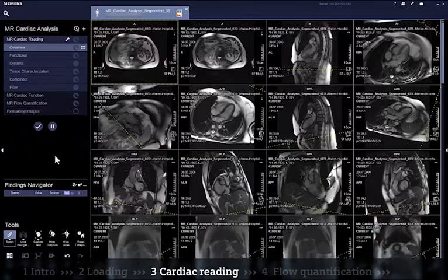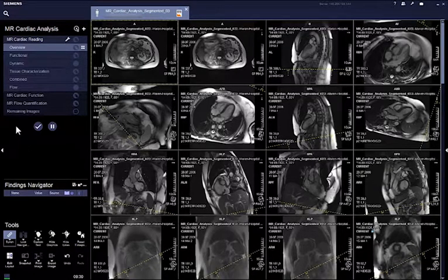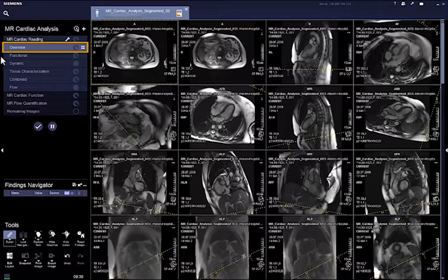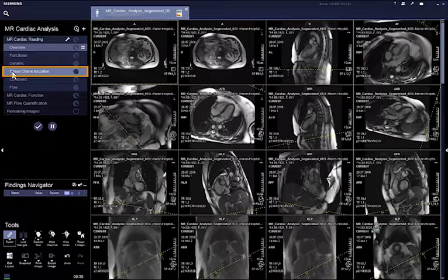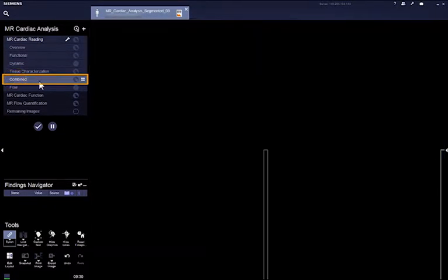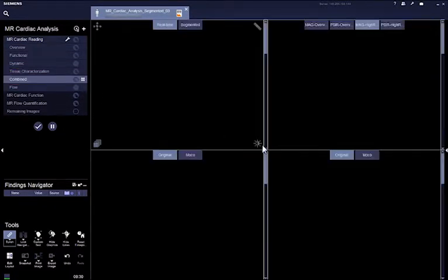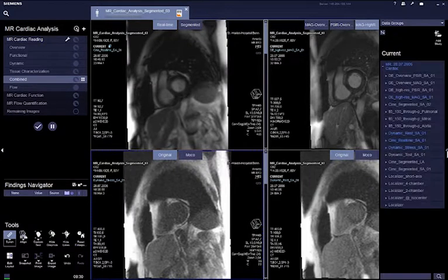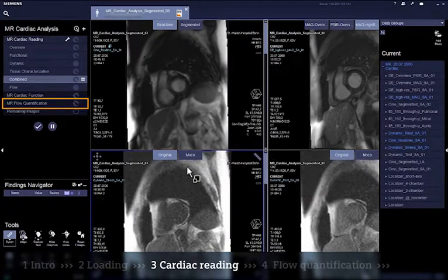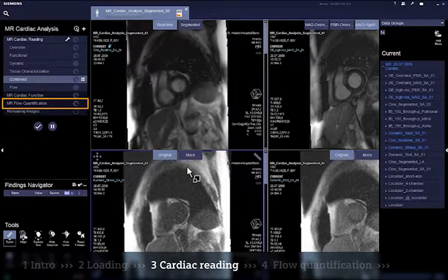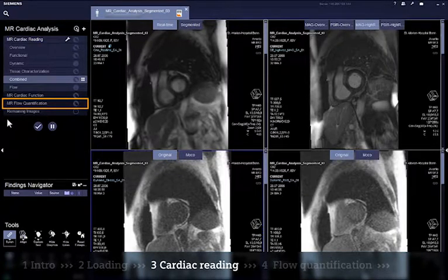In MR cardiac analysis workflow, all relevant images are automatically loaded into specific workflow steps or can be dragged and dropped with the mouse from the series navigator. Select the workflow step, MR flow quantification, which will automatically open the vessel segmentation step.